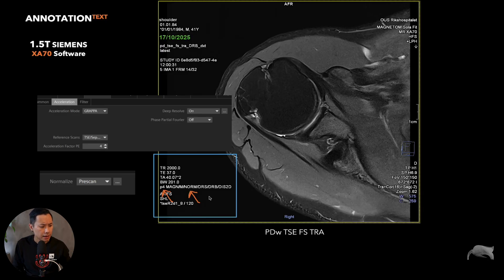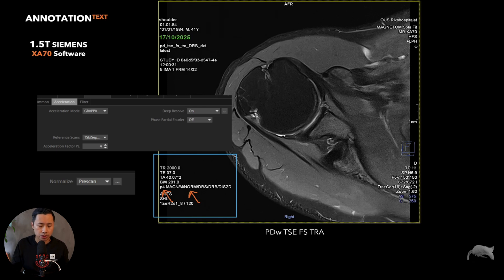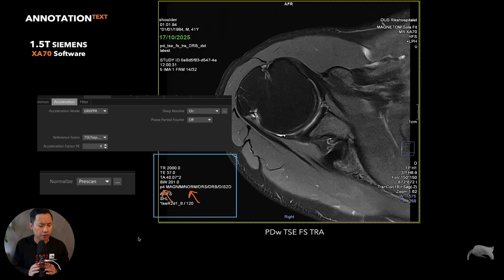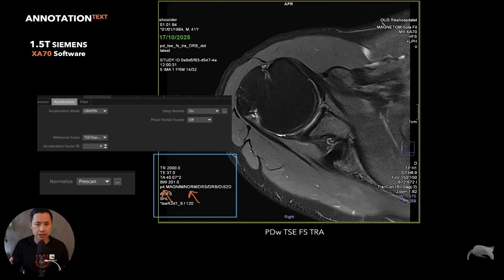This shows distortion correction 2D - you can have it off, 3D, or 2D. We use 2D all the time except for special measurements where you need full 3D, like brain lab sequences.